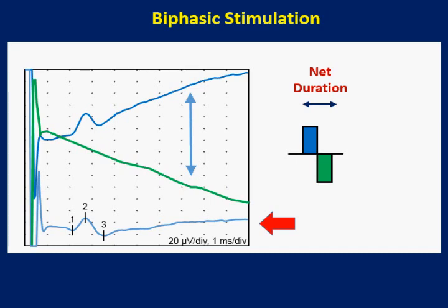The biphasic stimulation doubles the duration of stimulus pulse. Hence, it may not be effective when the distance between stimulating and recording sites is very short. The overall stimulus intensity change is also twice that of a monophasic pulse. This can also make the stimulation more uncomfortable.